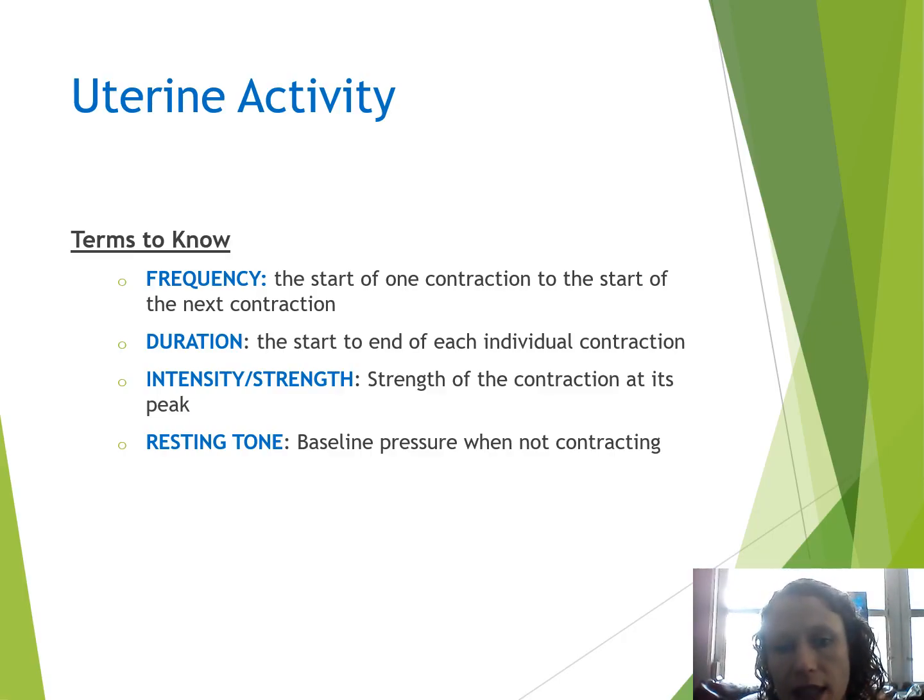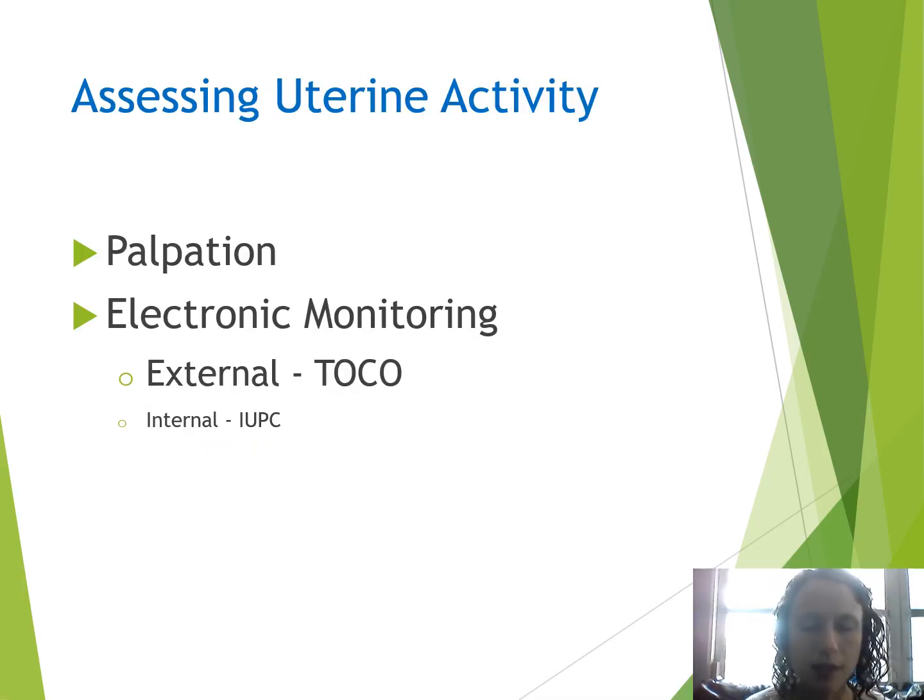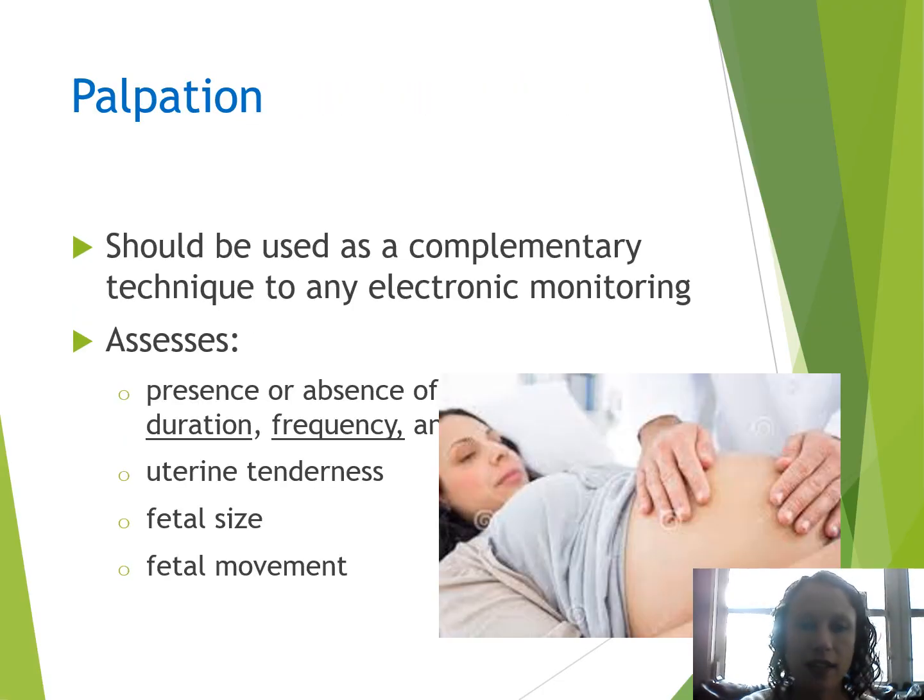Duration is the beginning of the contraction to the end of the contraction. So how long is the contraction lasting? And then intensity, like I said, the IUPC is the only way we can actually measure it on the monitor. Really the best way for us to tell the intensity of the contraction and resting tone is with our hands. So even if we have an IUPC on, we still put our hands on their belly, okay? Hands-on assessments. It's super important to do that palpation. I'm not going to jump ahead; I'm going to wait until I get to it.